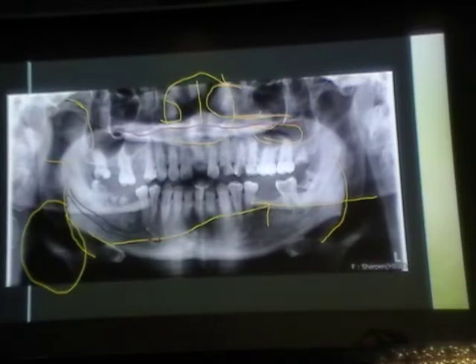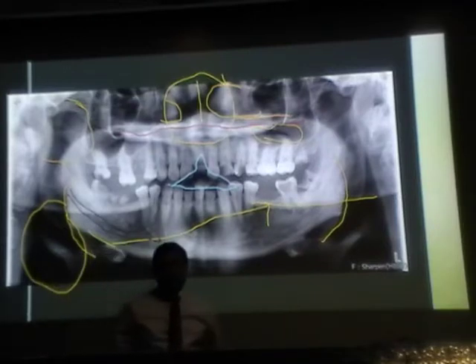Anything else? Yes. On the mandibular incisors, on the incisor surface, there appears to be a radiolucency there, this sort of triangle. What is that? So let me use a different color. It almost looks like, yeah, that triangle there. There is a little shadow off.